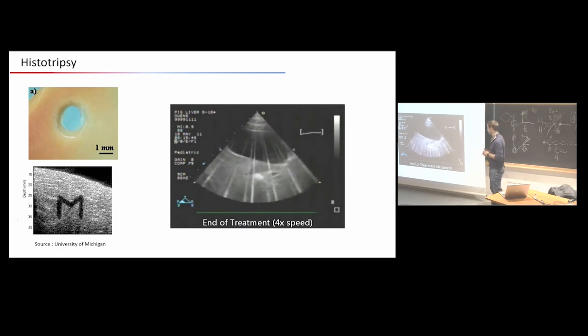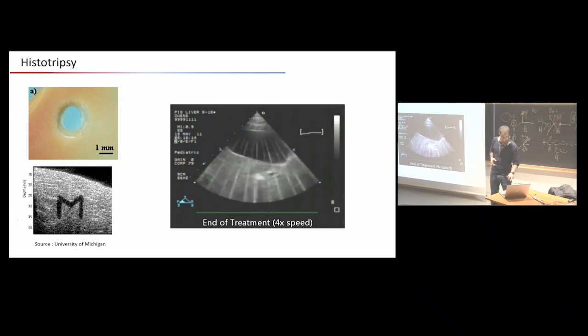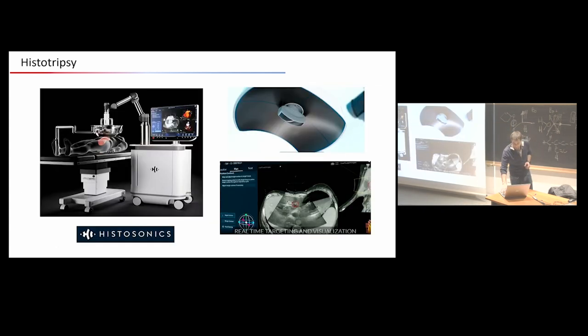And once they stop the treatment, you will see at the end of the video, should be soon. I don't know where is the end. Well, at the very end of the video, yeah, now they stop. You see, it's dark. There is no more tissue. It's just a hole.